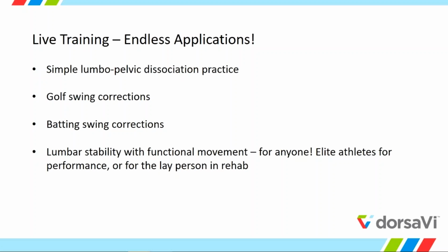Yeah, essentially for a stability example, I still see patients once a week, and I'll use it for an RDL. I came into this clinic and sometimes the tech was taking people through exercises and I was kind of cringing. So I'll run over and put the sensors on and say, okay, now I want you to keep those balls right where they are.